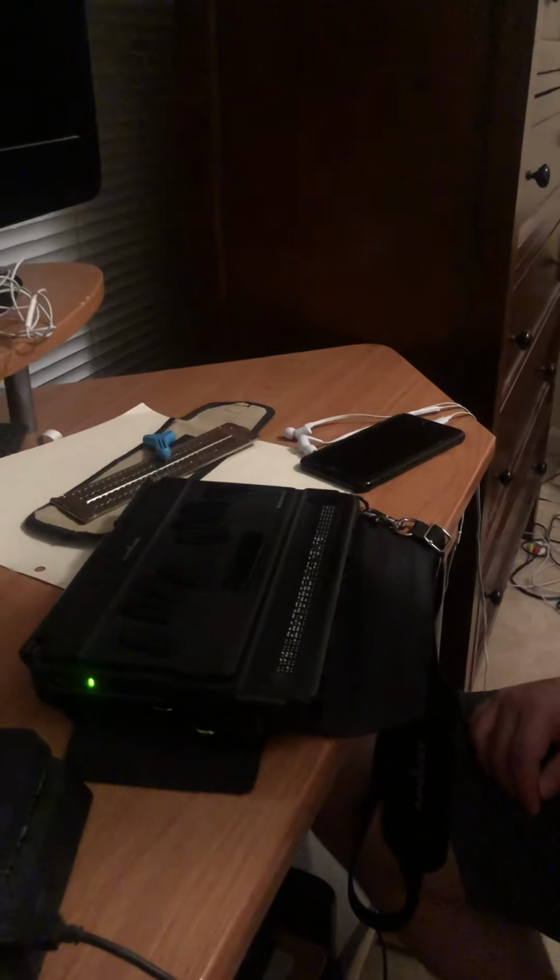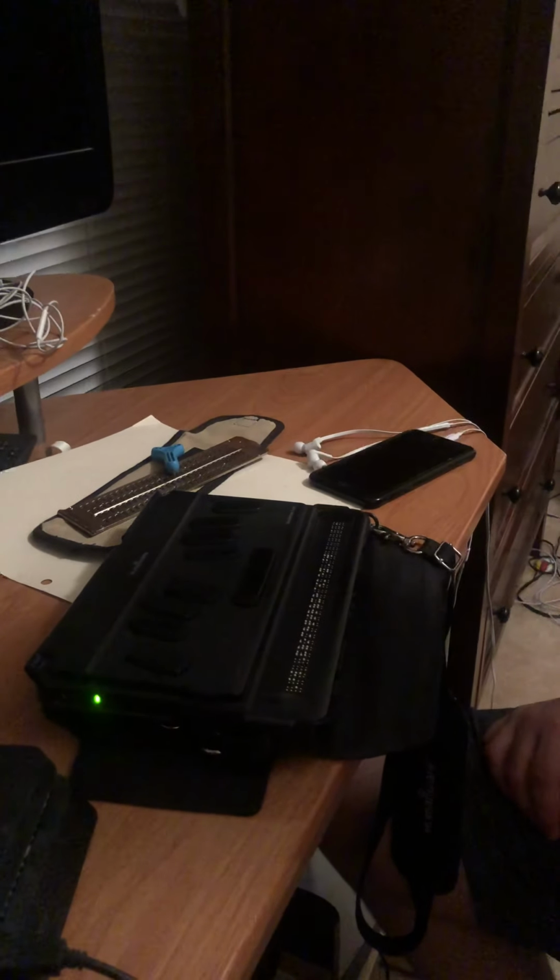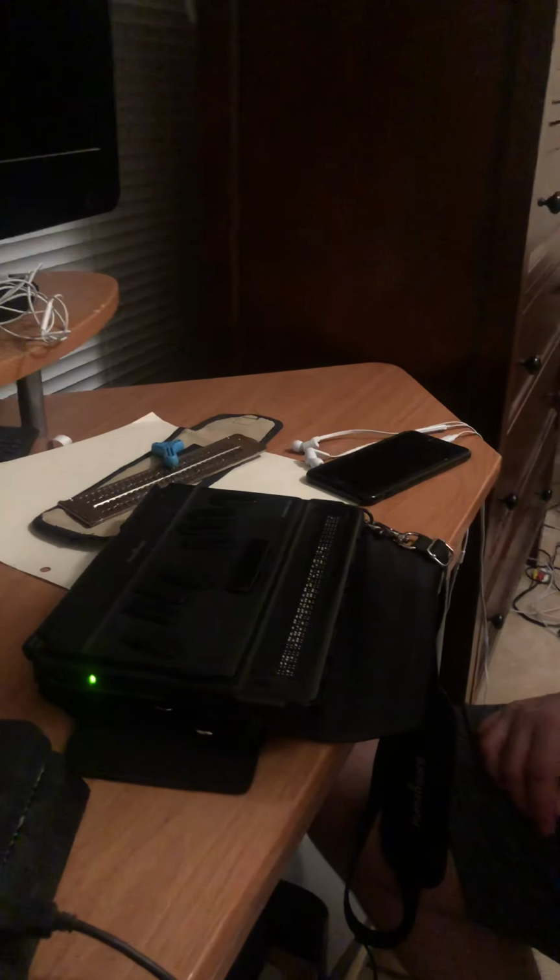So that is a little bit about the Braillenote, guys. This will wrap it up for my accessible technology tools part 2.